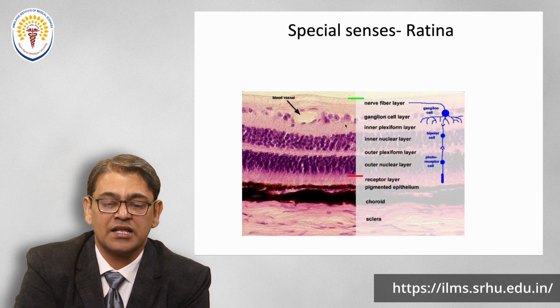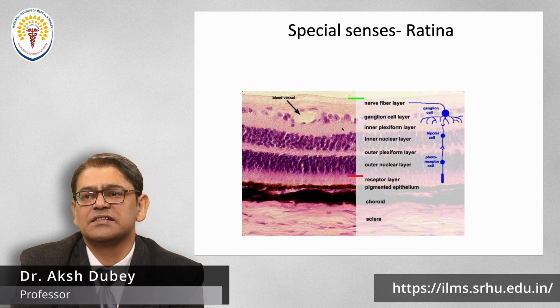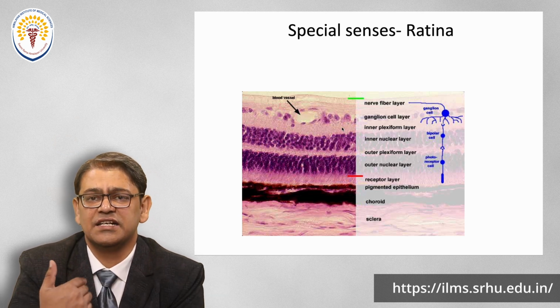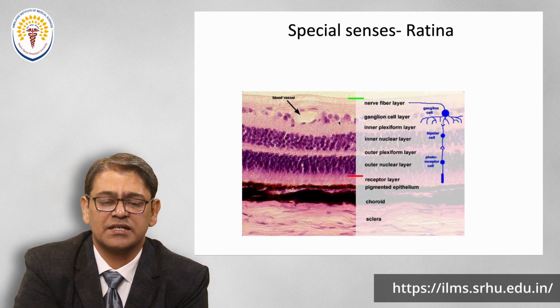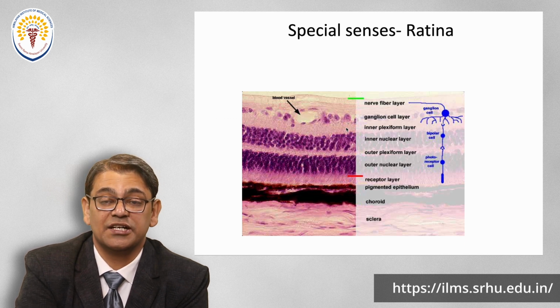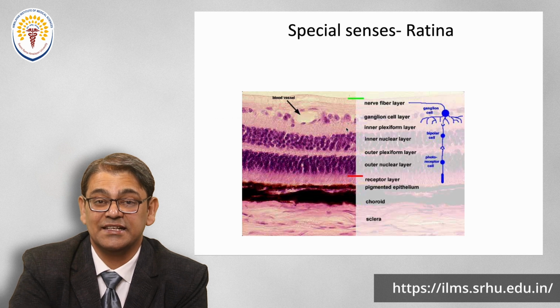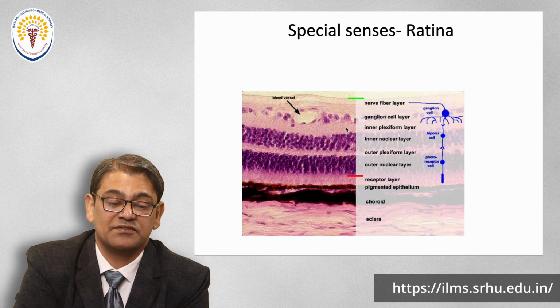Here we see the plexiform layer. Since it is inner, why is it named inner plexiform? Because it is inside, not outside, and plexi means network. Here we see the neurons of the ganglionic cells and the downward bipolar cells present. The mixing is there. That's why this relatively clear zone is named the inner plexiform layer, though it's not really clear, it's filled with a lot of intermingling wiring. That's why it's named the plexiform layer.